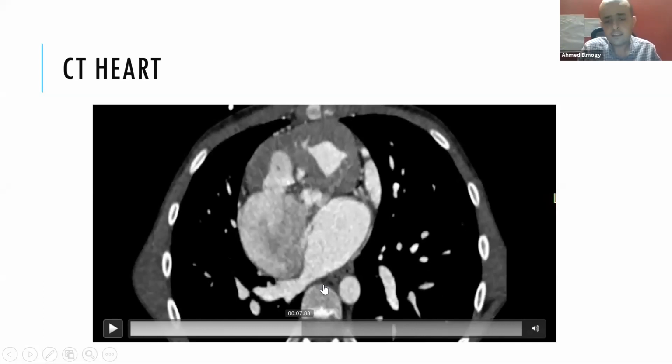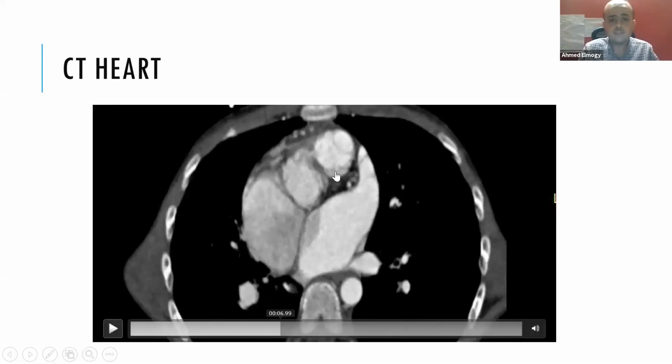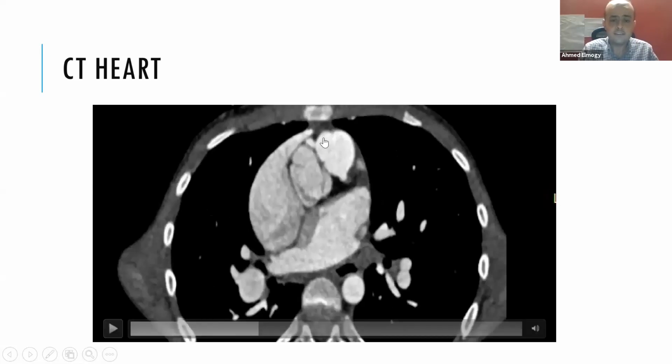So we can detect even the complication, and we can also look at the coronary artery morphology, as we previously said. This is the right coronary sinus, sinus 2, but this is from the other side. It's not the surgeon's view. So just for simplification, we can also describe the origin of the coronary arteries in those patients.